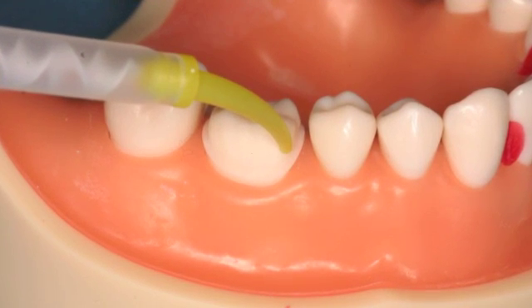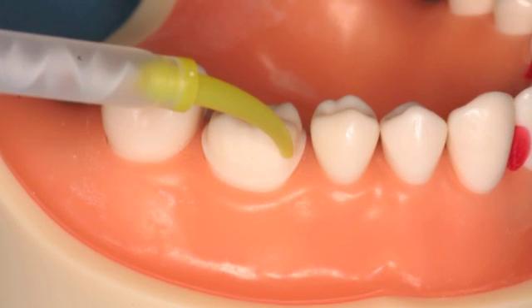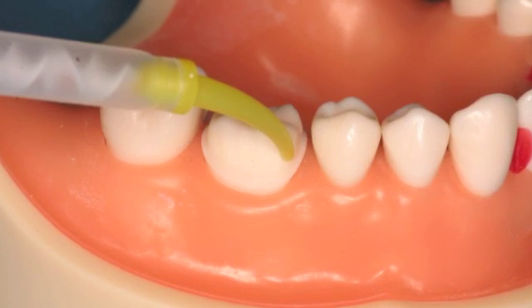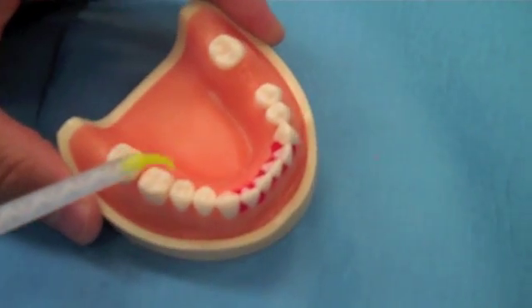The small tip cannula of the light or medium body impression material should be placed above the crevice and injected downward to capture the margin. This is an example of injection of medium body PVS.